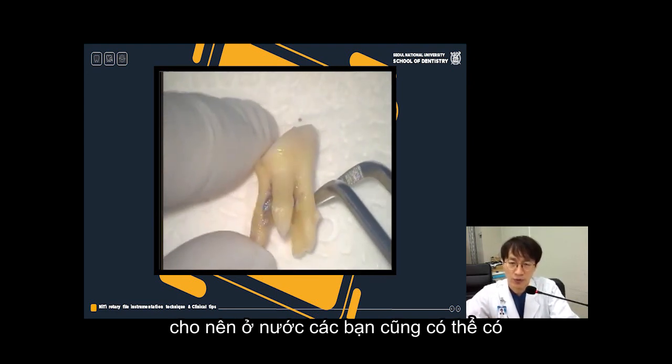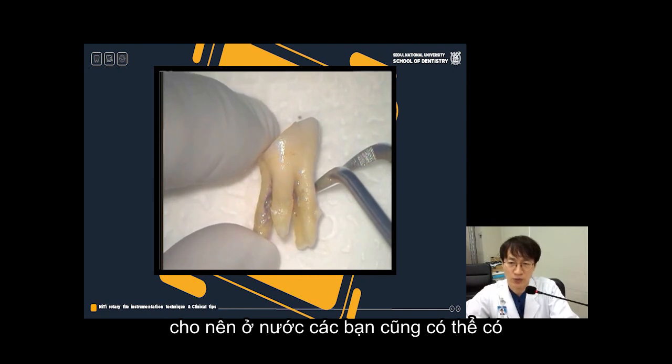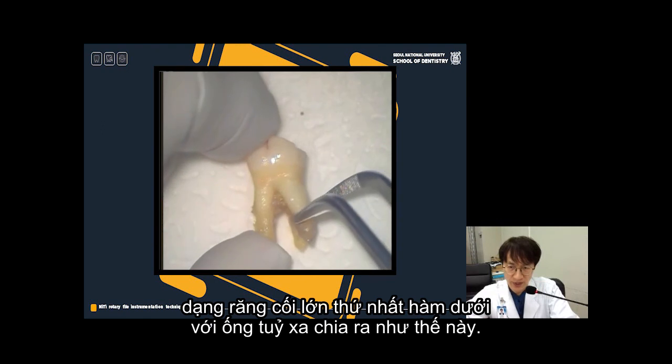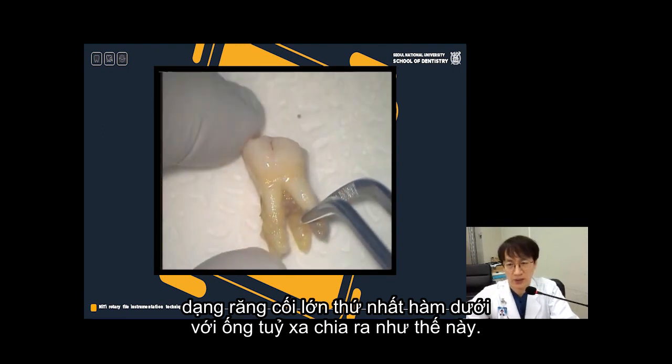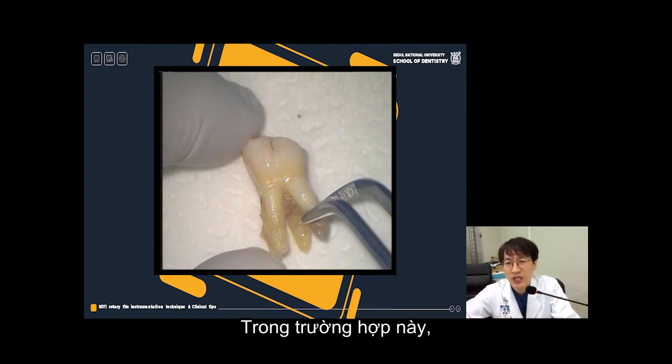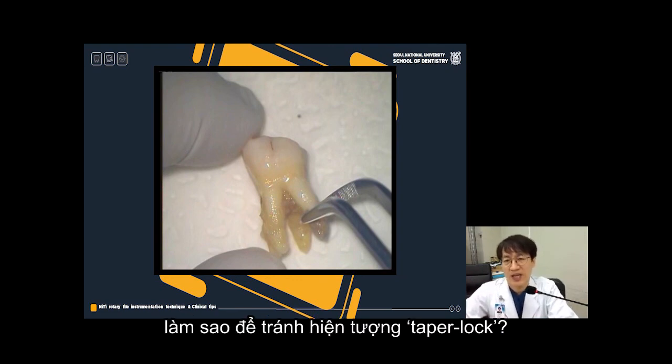So probably your country also has this kind of tooth at the lower first molar with separated distal canal. So distal lingual, we can figure it out. This is with a little bit severe curvature, it's hiding. So in this type of case, how can you reduce taper lock phenomenon?